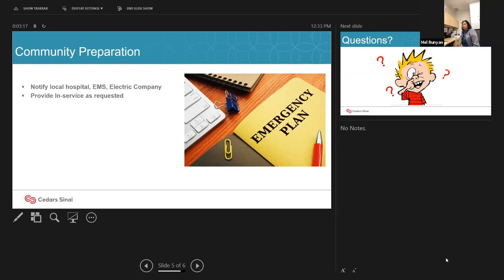The other thing we do post-discharge is the clinic. We've discharged about 42 patients on Freedom over the course of the years that we've implanted. The most we don't see them is 4 weeks, a month, but we see them weekly for at least 2 months.